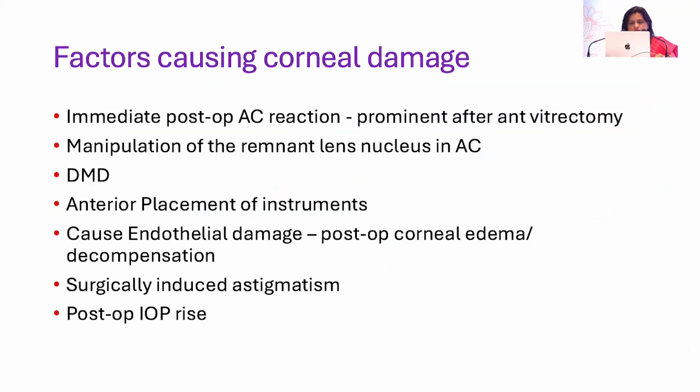Now, factors which cause corneal damage are immediate post-op AC reaction, which is prominent.